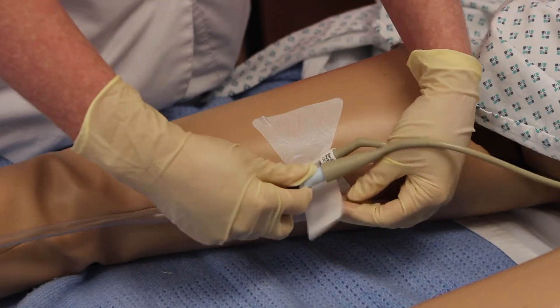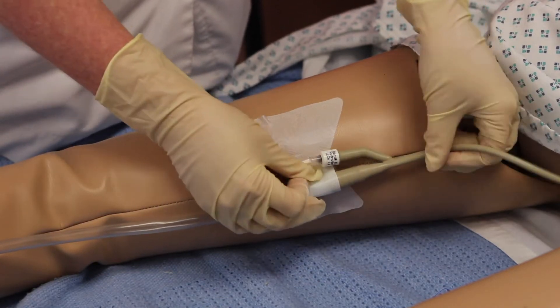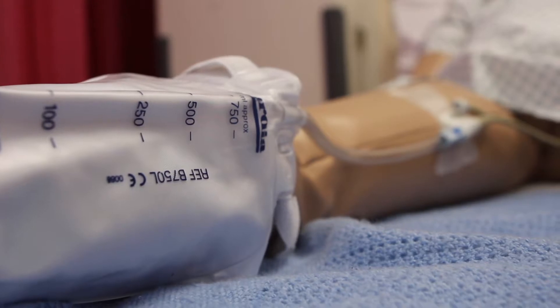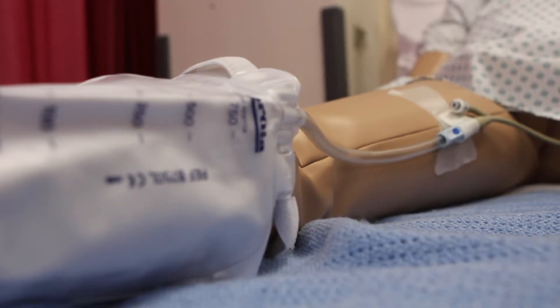When using a leg bag or flip flow, the urinary catheter can be secured using an adhesive secure device. This is stuck to the inside of your thigh to prevent excess movement or tension on the urinary catheter. Leg bags and flip flows are to be changed no more often than once a week to reduce the risk of introducing infection.